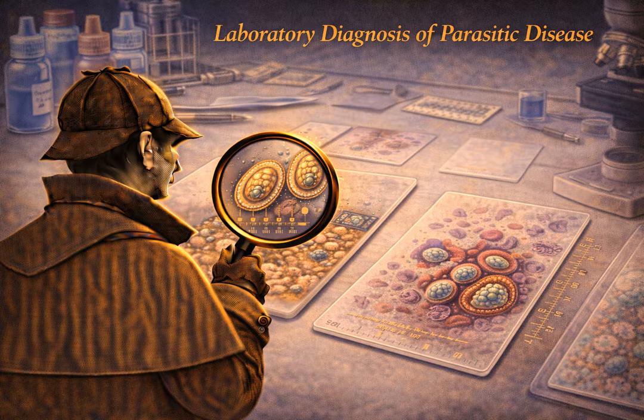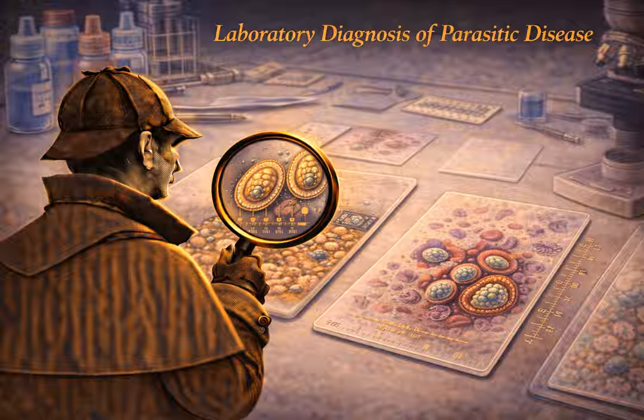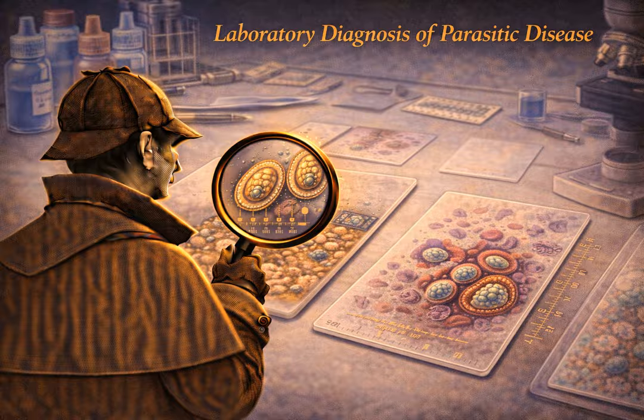But there's a massive logistical trap here that Murray explicitly points out, and clinicians fall into it constantly. The fixative trap. Exactly. Remember, way back in Section 2, we explicitly said, put the liquid stool immediately into formalin or PVA to preserve the delicate cell structure for the microscope. Right. Stop the trophozoites from rounding up and dying. Well, formalin works chemically by heavily cross-linking and denaturing proteins. That process aggressively fragments and damages nucleic acids. It destroys DNA, and it completely inhibits the Taq polymerase enzyme that is required to run a PCR reaction.